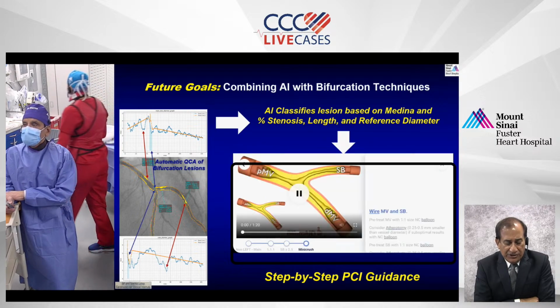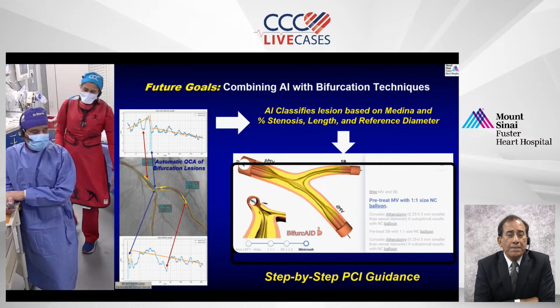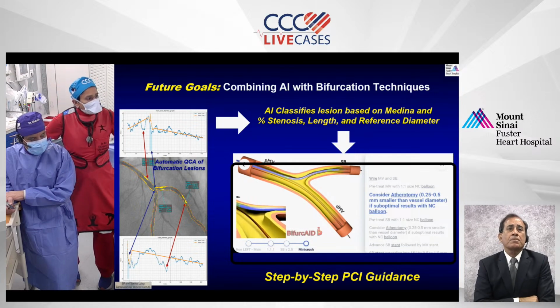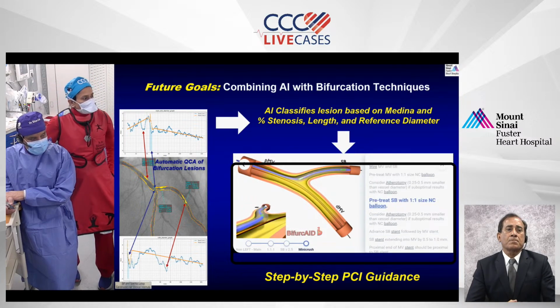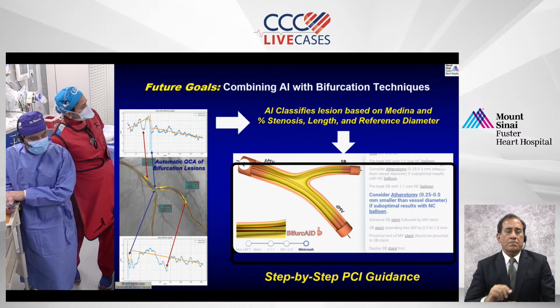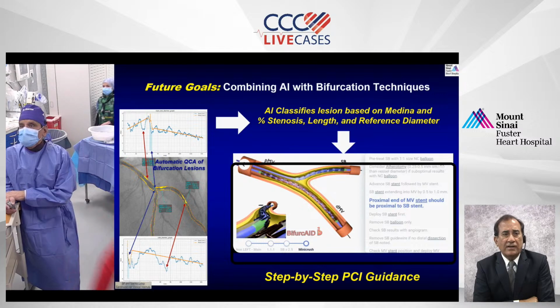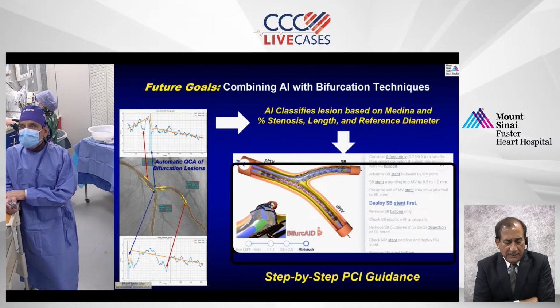Samin, there is a question. Video-based work and angiogram-based work, it's not there yet. Okay, Sina is the first one to be doing this kind of work. Yeah, excellent. And I know you're on the right path.